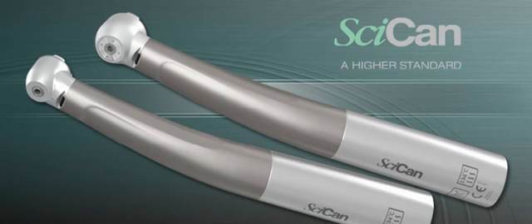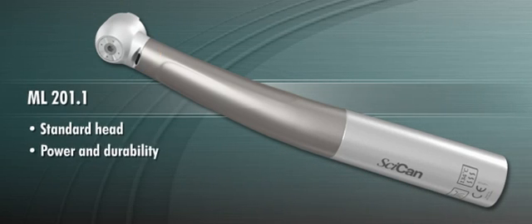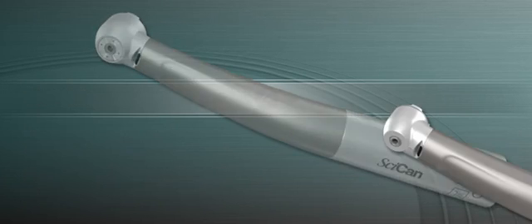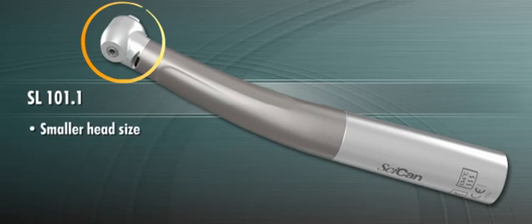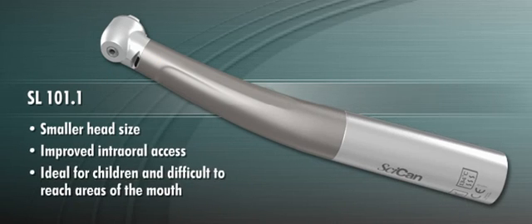SICAN offers two high-speed air-driven handpieces to cover all clinical situations. The ML201.1 with standard head provides the power and durability you need for precise restorative and crown and bridge procedures. The SL101.1 offers a smaller head size which provides improved intraoral access, making it ideal for working on children and difficult to reach areas of the mouth.